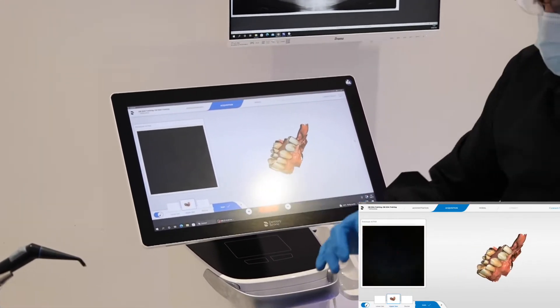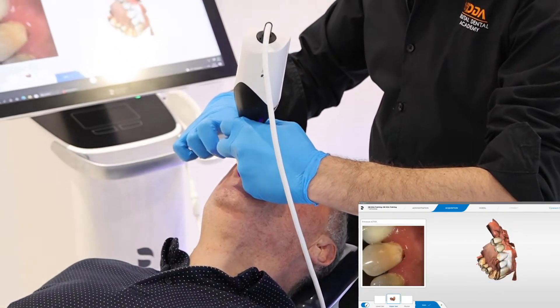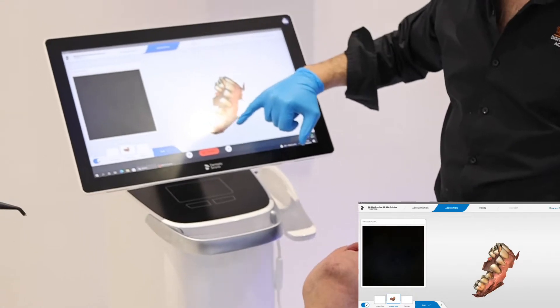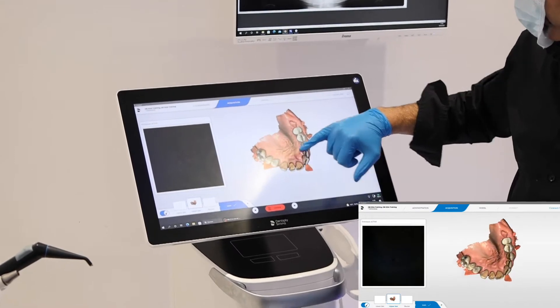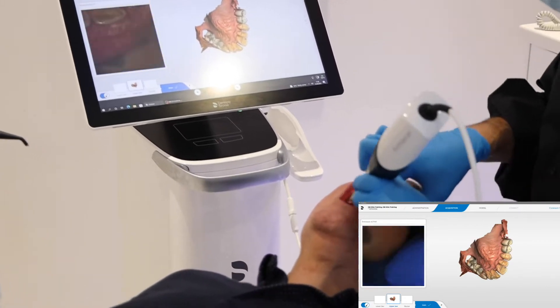There are a couple of spots there we want to finish scanning, and that's the top tool done. We want the soft tissue extension and a few millimeters around the actual teeth as well, and that will allow us to get a nice export for the STLs we need.